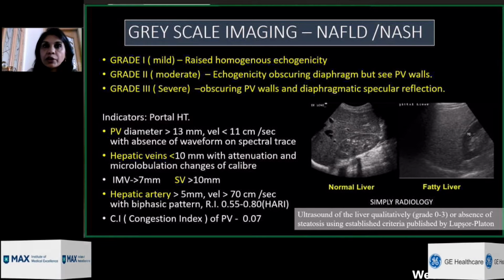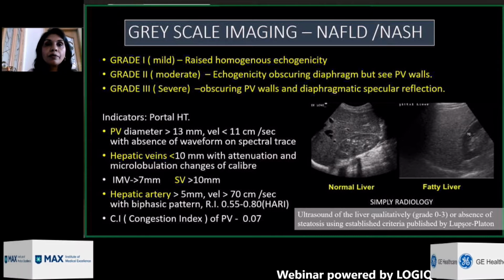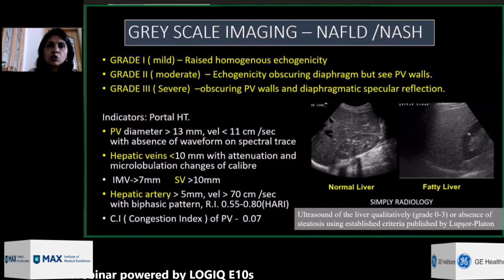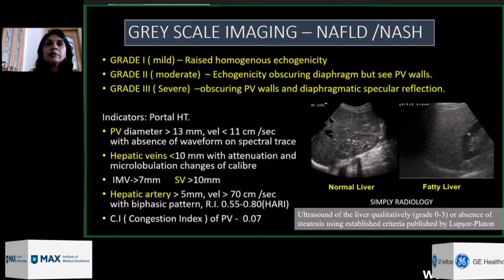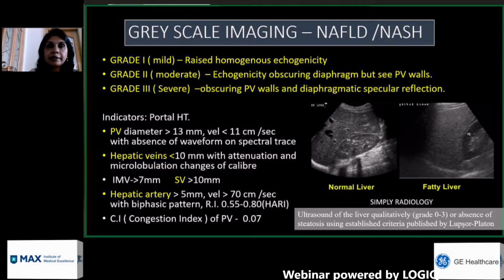It is subjective, and there is no standardized measure of echogenicity. However, on grayscale imaging, it is important that, as radiologists, we reach some sort of consensus so that by way of grading, a qualitative response can be given to lend credibility to the presence of fatty liver.